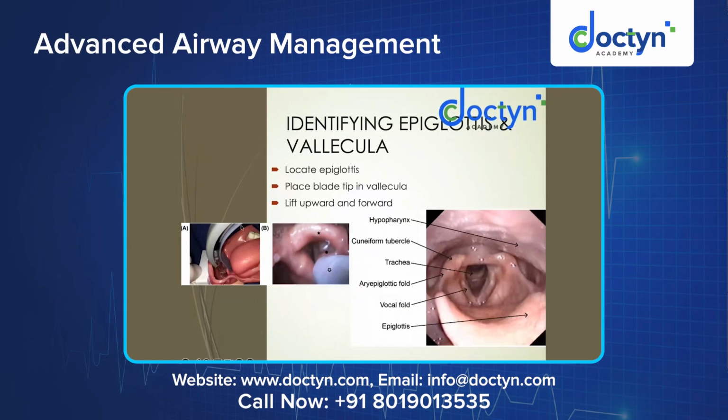This is how it is. See the image A, where the tip of the laryngoscope blade is going till the posterior part of the tongue. Above it is the epiglottis. Just below that epiglottis, you will be able to see the vocal cords, and this ET tube is being inserted or advanced through that.